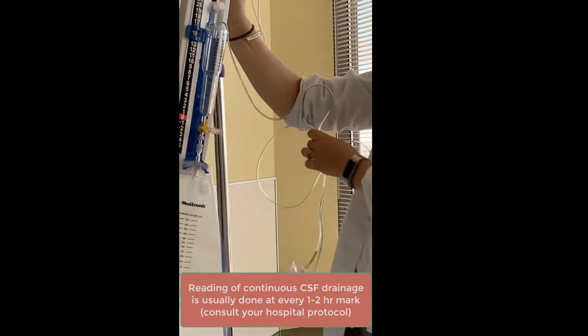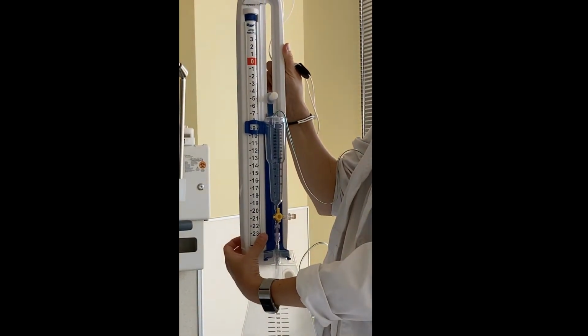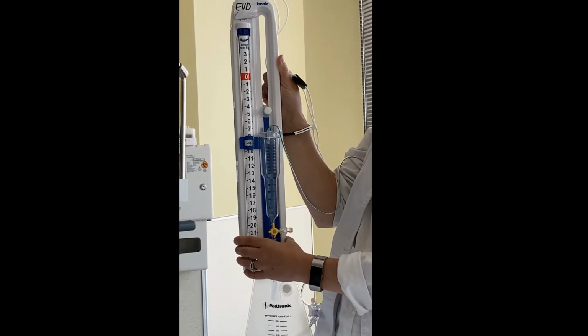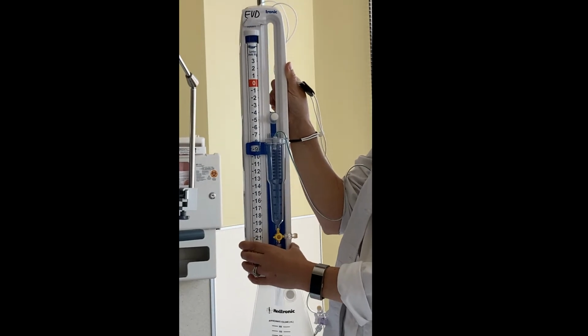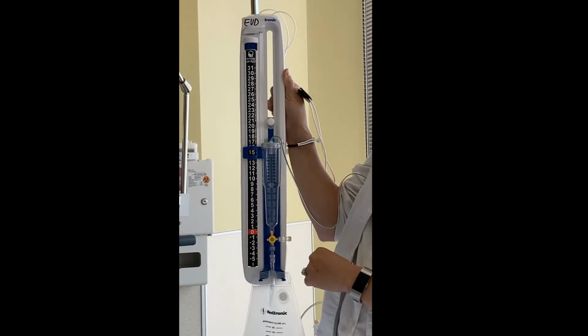Okay, so here you will also notice that there's a different gradation meter for different types of drains that exist. So the drain can actually be used for lumbar drainage. We are still draining CSF because CSF circulates in the subarachnoid space around the spine as well, or it can be used for ventricular drainage.